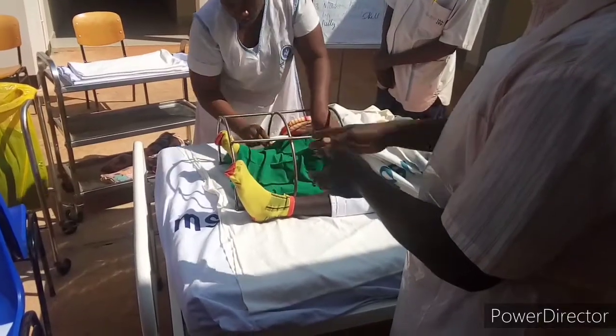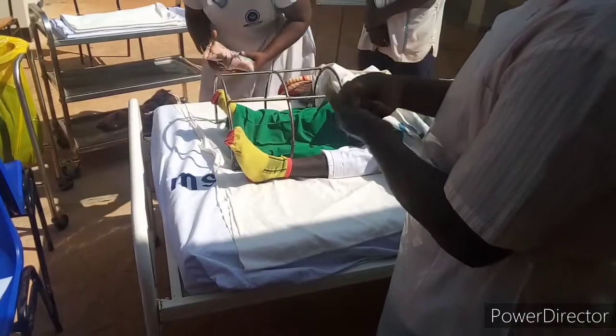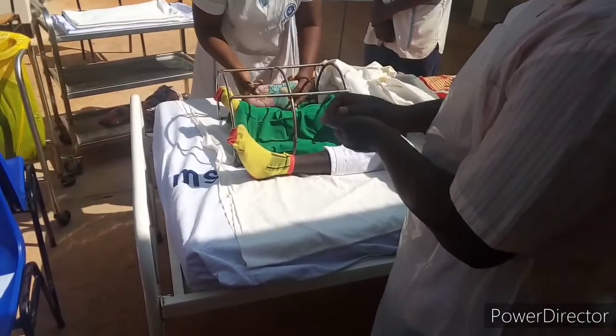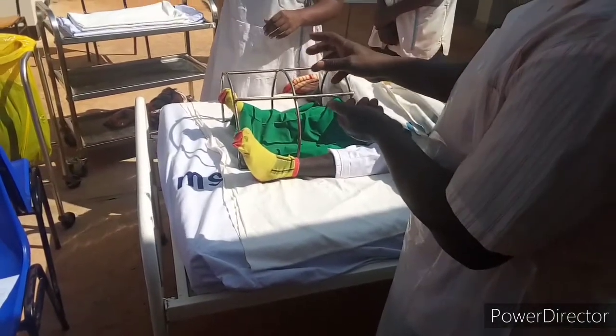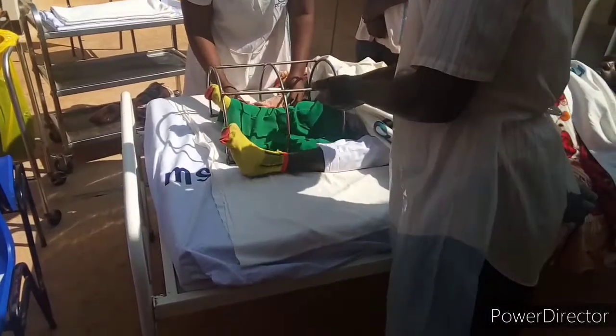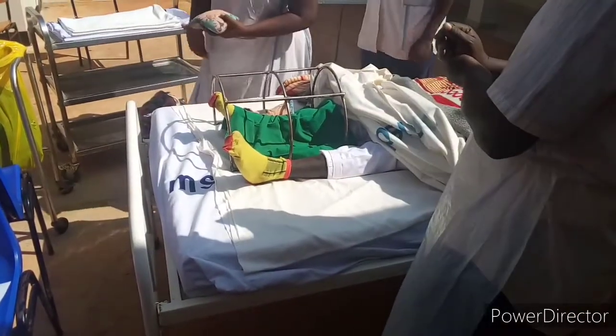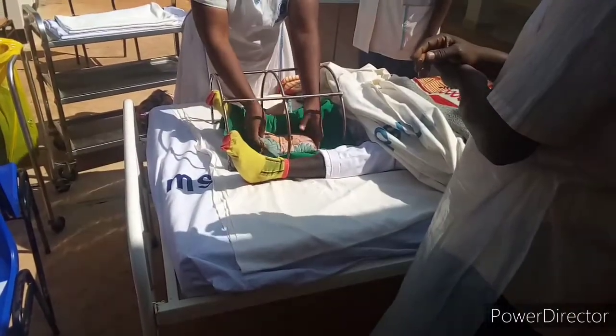Welcome, this is Viamiru TV. This is a procedure for making an amputation divided bed. As you will see in my video, that is a sandbag. The sandbag is pressed inside each side of the sterile dressing towel.